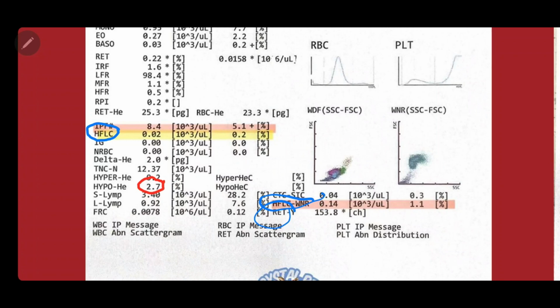Presently, hypo-He is used by renal disease organizations as one of the diagnostic values. Personally, I can say that hypo-He is more accurate than SDMA, creatinine, and BUN. Hypo-He is superior, but it is still not widely understood. Moreover, hypo-He also relates to iron deficiency, so multiple values should be considered in the diagnosis.